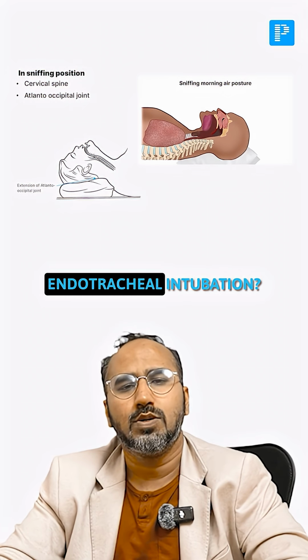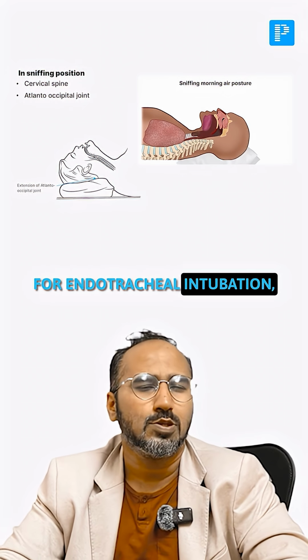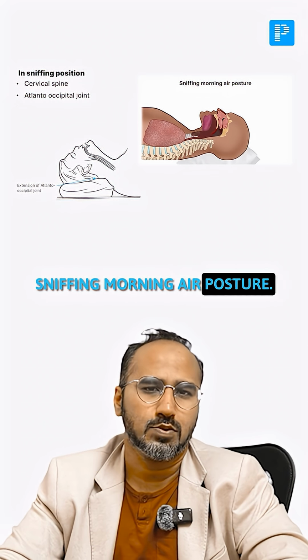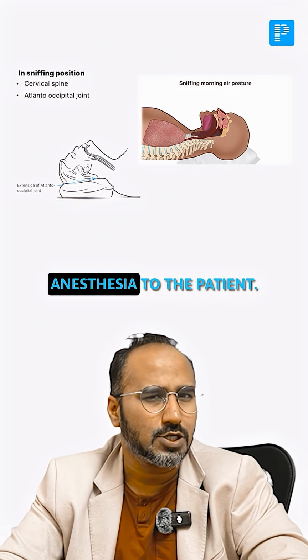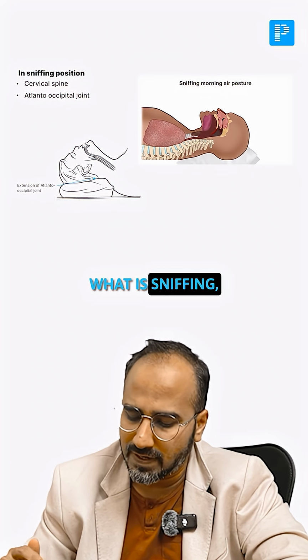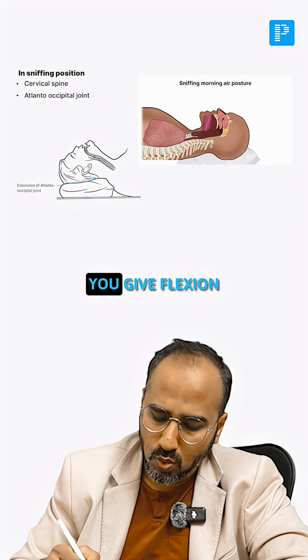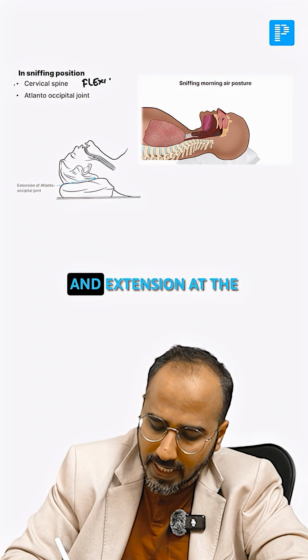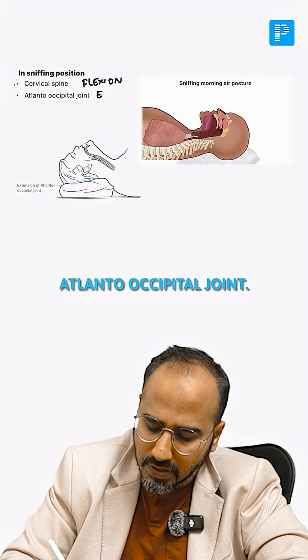How will you go for endotracheal intubation? For endotracheal intubation, guys, we need to keep the patient in which position? Sniffing morning air posture. Imagine you are giving general anesthesia to the patient. So you take the patient in a sniffing morning air posture. What is sniffing morning air posture? You give flexion at the cervical spine and extension at the atlanto-occipital joint.